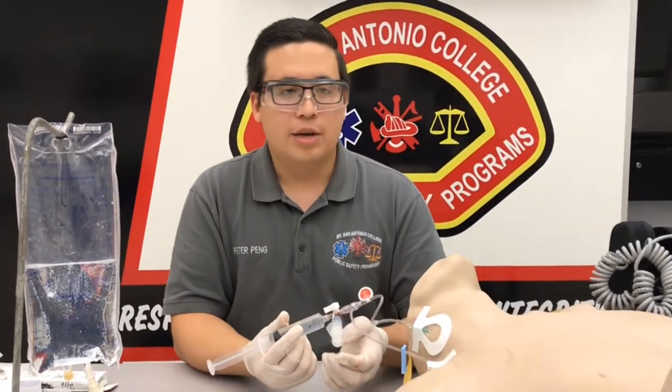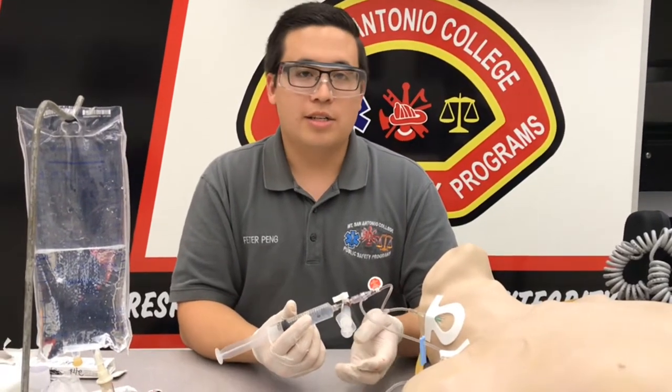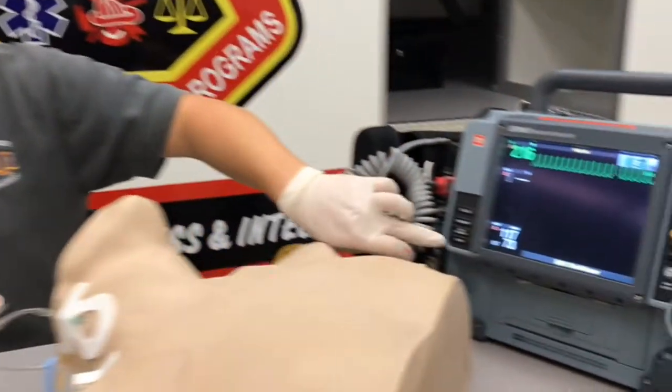Make sure that your patient's aware that they're going to feel maybe some chest pain or shortness of breath, some nausea, and some other adverse effects. Right before we push this, we're also going to hit print on the monitor, so I'll go ahead and do that.